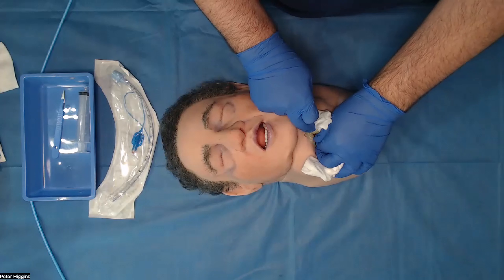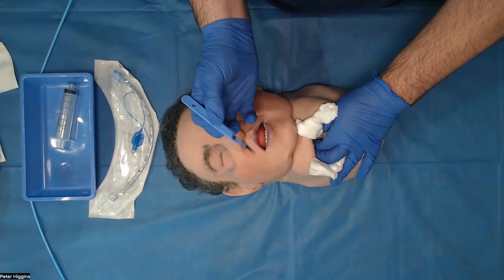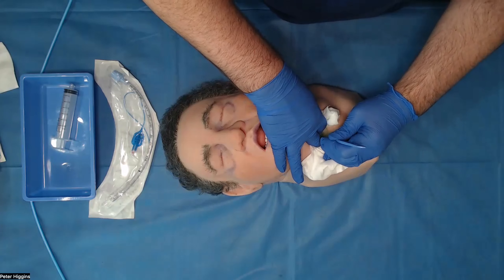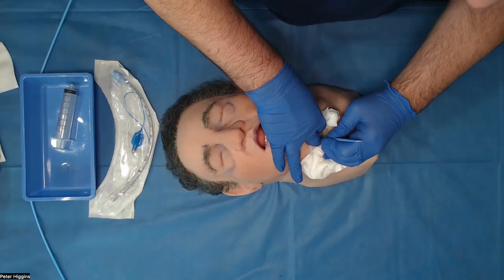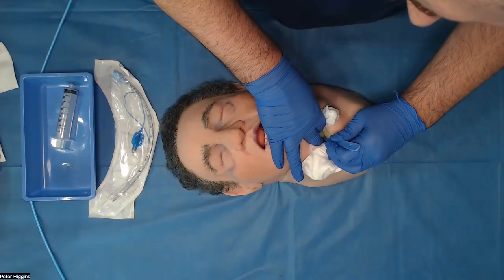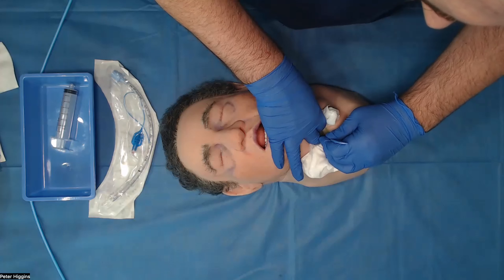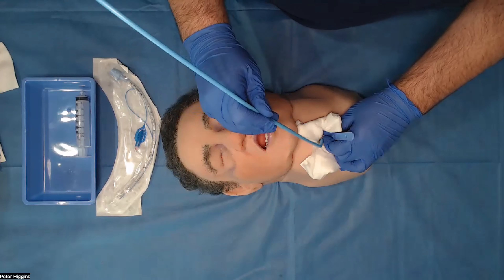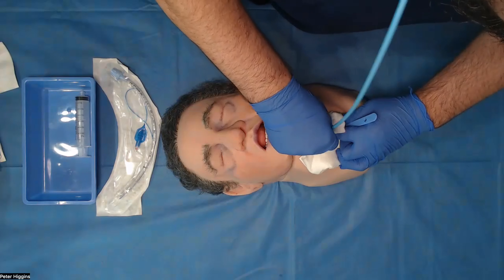Palpating with my finger, I can feel that trachea. I'm going to retract that open with my fingers. Take my scalpel — in this big, deep, dark hole here, I'm going to make an incision into the trachea. Then turn the scalpel to try and use it as a retractor. I'm going to take my bougie here and insert it into the hole that I've made in the trachea.